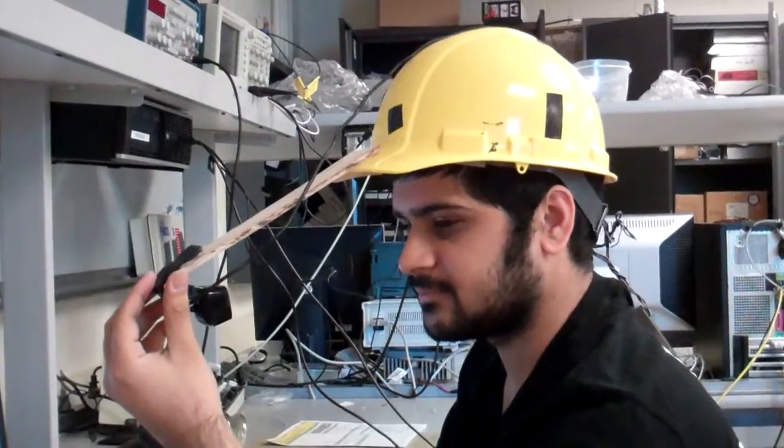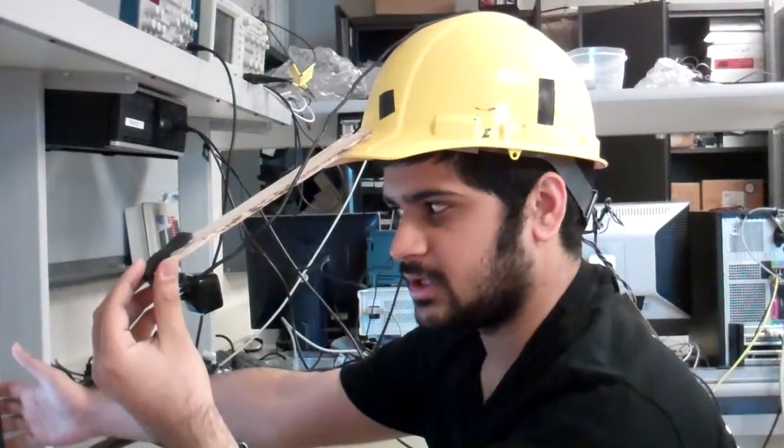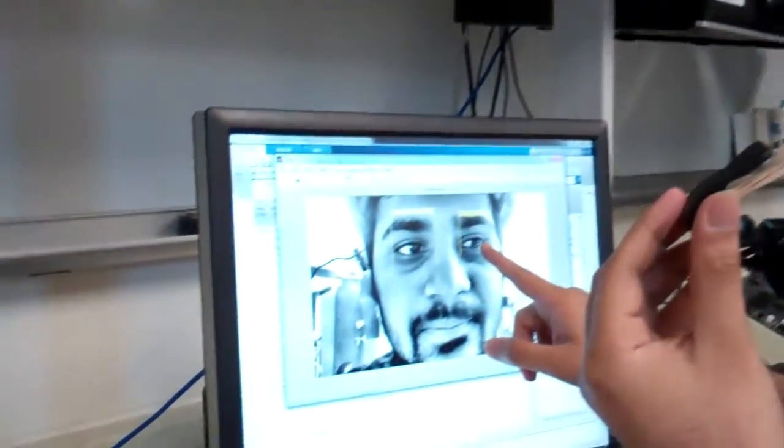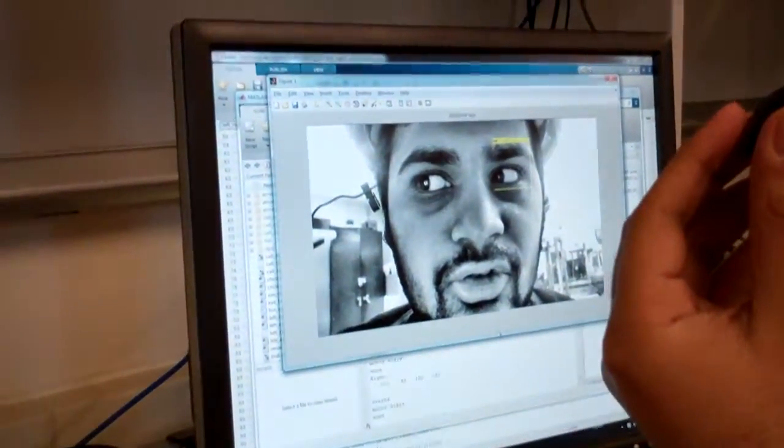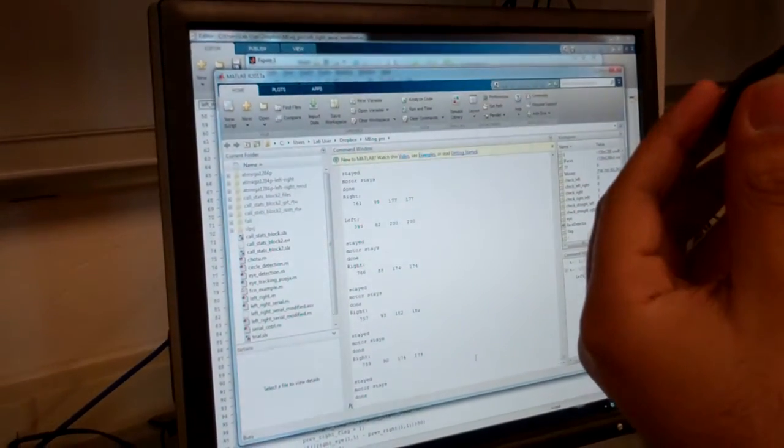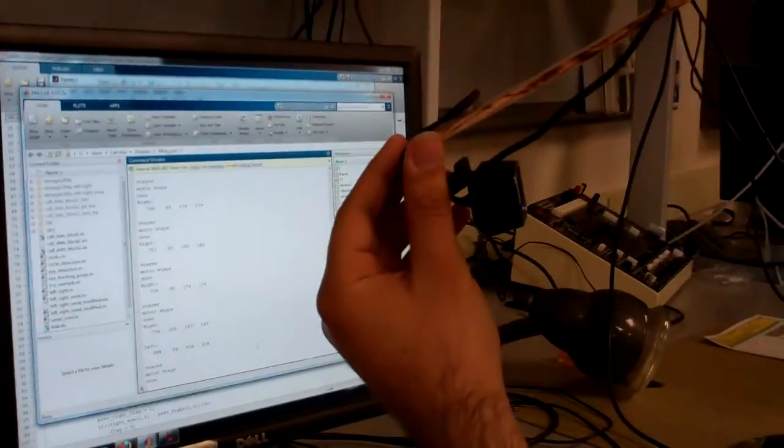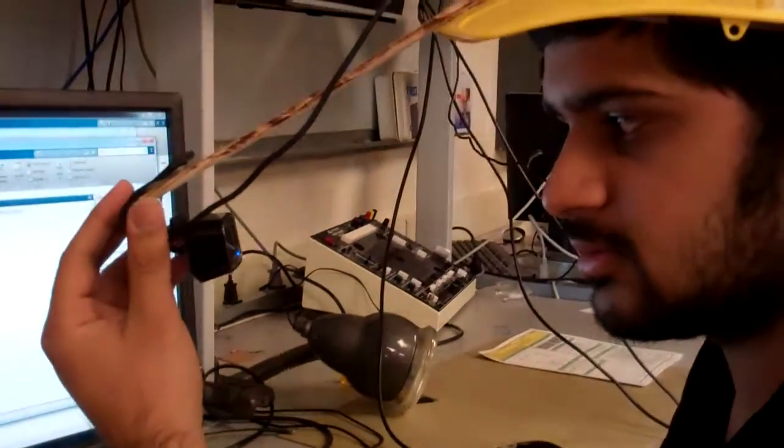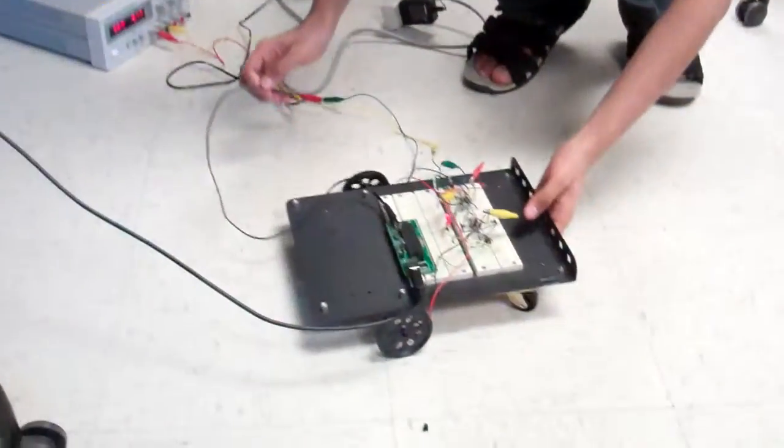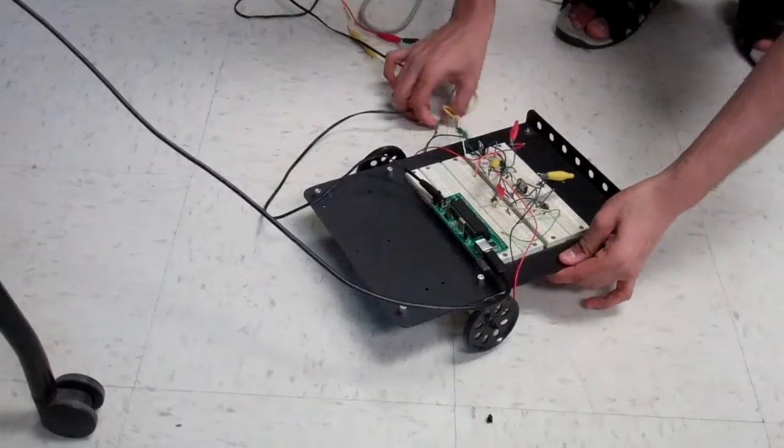So here's the debug screen where I'm just showing my eyes. It just detects my eyes, the MATLAB program. And then what I do is, for example, when I look in the left side, and my wheelchair will move on the left side after that. So you're moving, you're looking left and it's moving left.